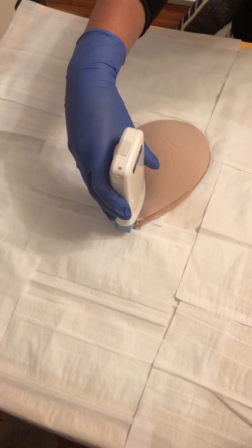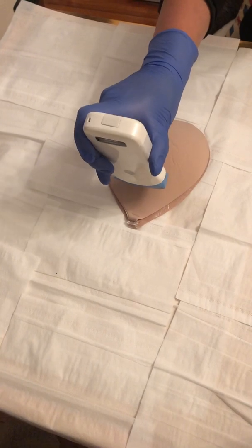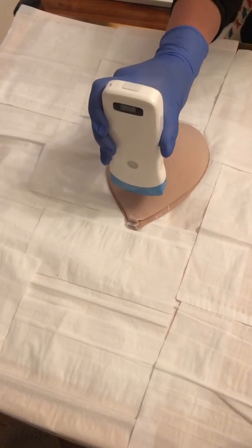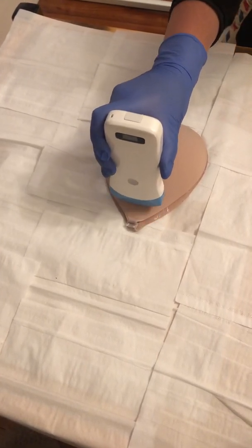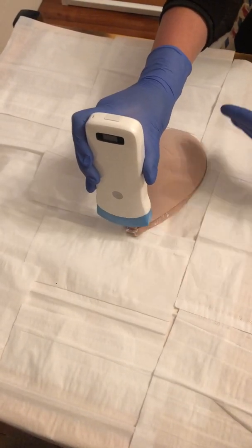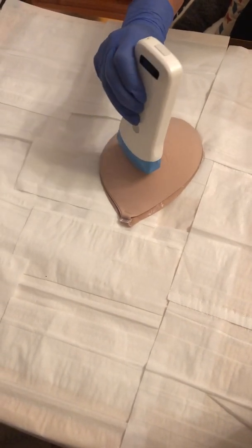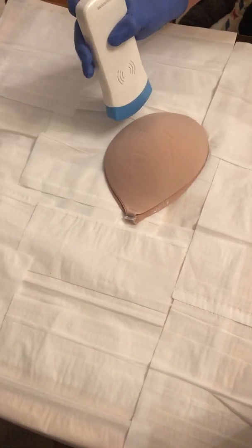So now showing the anti-radial, we've got the marker facing the patient's right and we are in a transverse plane at a perpendicular angle. We'll be moving for the anti-radial plane. We're going to be moving from inferior to superior. So just moving up, inferiorly, superiorly, and as you can see, starting at 12 and just repeating that scan all the way around, medially to the nipple, superiorly, and then back towards the nipple. So we'd rotate all the way around to 5 o'clock.